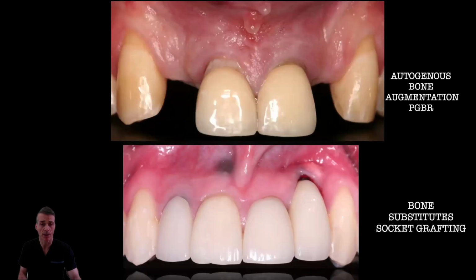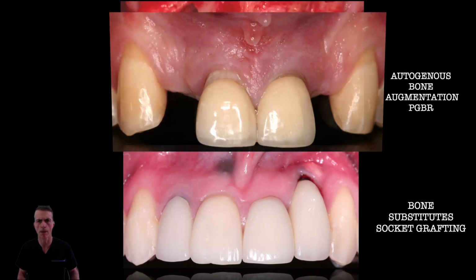And especially if the implant is placed in a not so ideal 3D position, placed to buccal, such as the case you see on the bottom, on top of the process of peri-implantitis, the implant was placed to buccal, and that definitely led to aesthetic issues. The case on the top was done many years ago, over 20 years ago by myself.